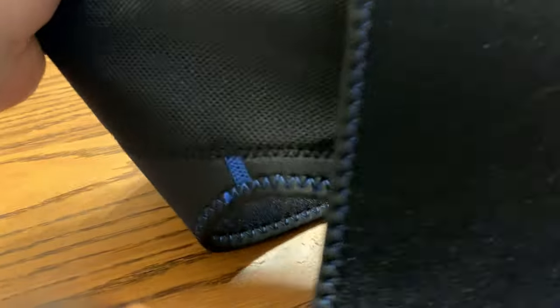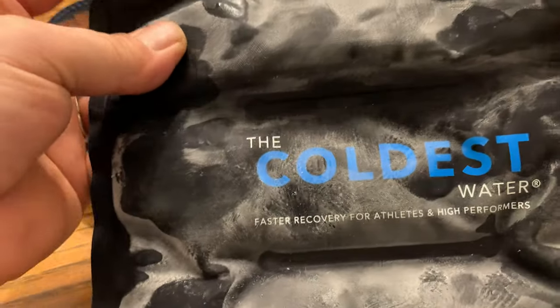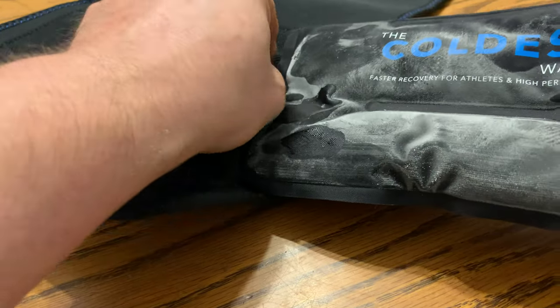It comes with an ice pack that you throw into the freezer. It goes into this sleeve here, so you just put this into the freezer and freeze it. It's nice and cold and it stays cold for about 20 minutes.